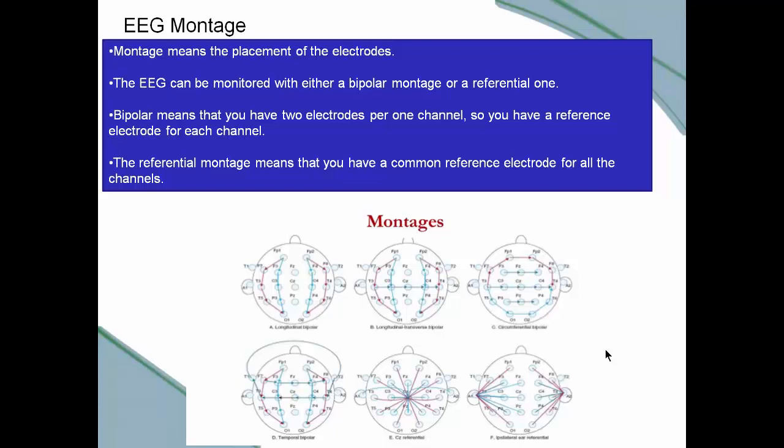But in that, you have extremely accurate readings because you're measuring, again, each measurement is referenced to that channel which is being measured, as opposed to a referential montage, which means that each point that's being measured is referenced to a point that is further or closer away. So if you've got some reference point, let's say in the middle of the skull, in here somewhere, each one of these points is being referenced to that. So whether it's close or far away, that's the reference point.